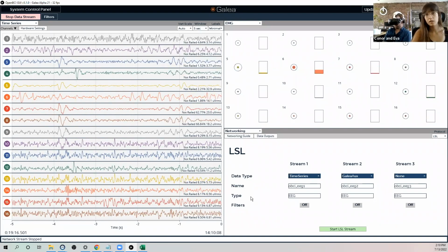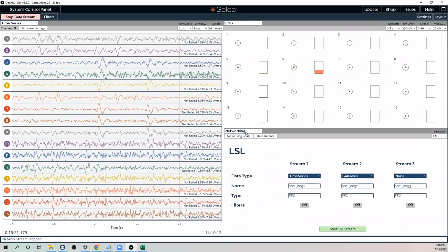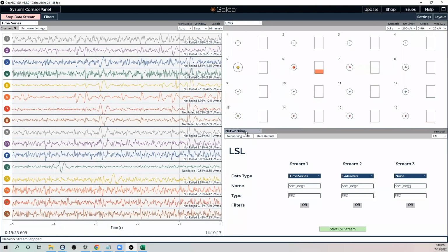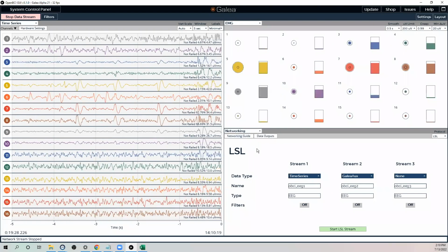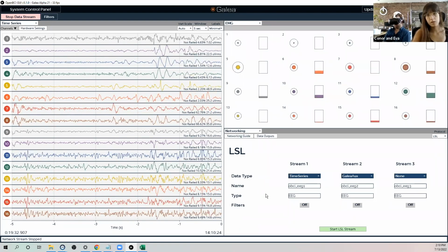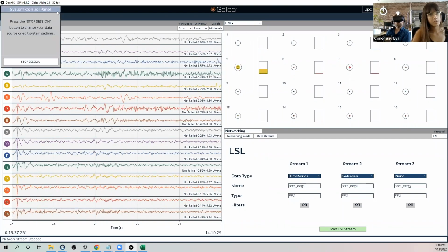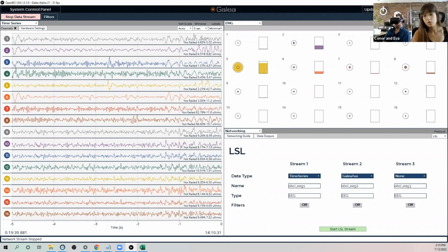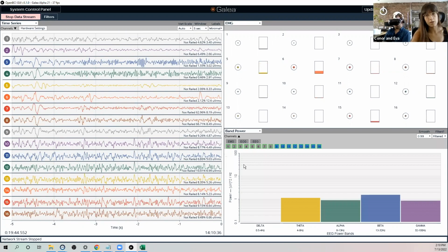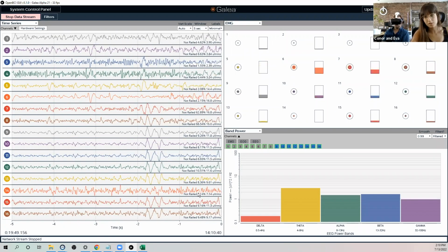Jessica Wilson asked about the sampling rates: are all feeds locked to a single setting, or can we set variable sampling rates between channels? That's a good question. Eva, do you want to jump on this? So right now we are using a 250 hertz sampling rate. We're using 250, but we've successfully got 500 hertz working, and we are working to bump it up to 1,000 hertz.